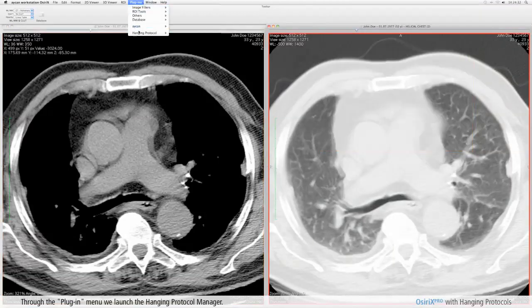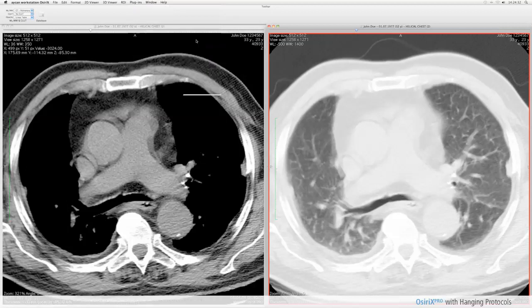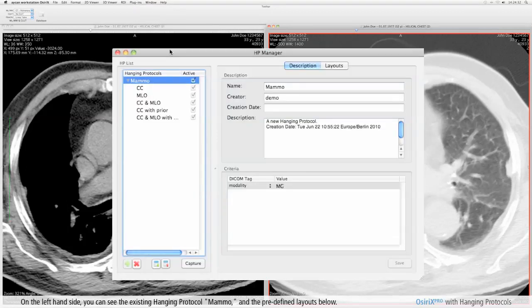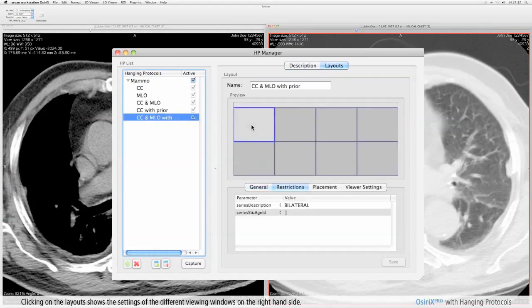Through the plugin menu we launch the hanging protocol manager. On the left hand side you can see the existing hanging protocol Mammo and the predefined layouts below. Clicking on the layout shows the settings of the different viewing windows on the right hand side.